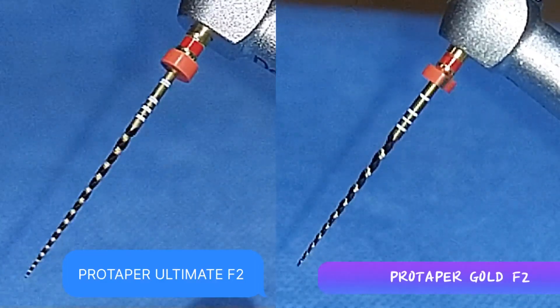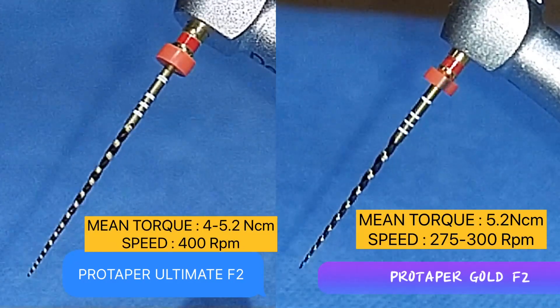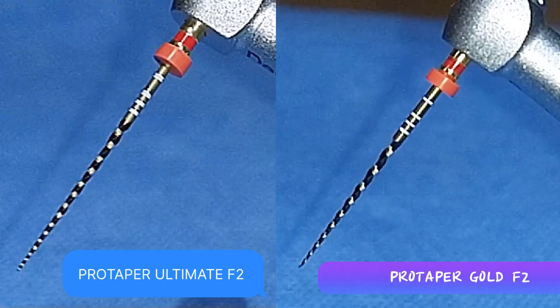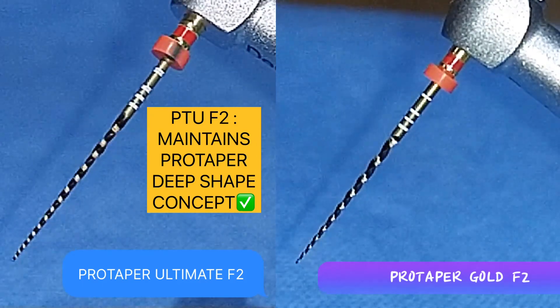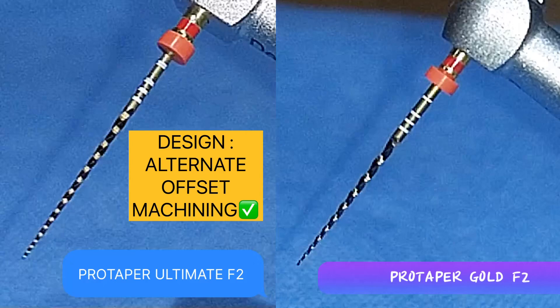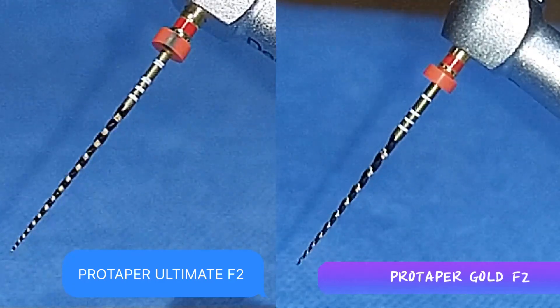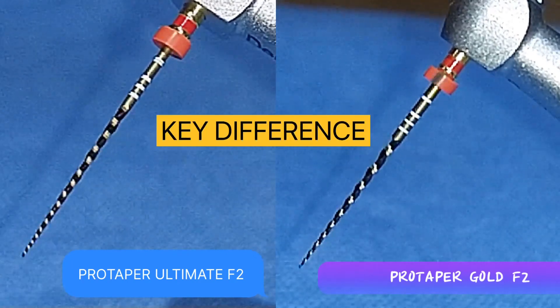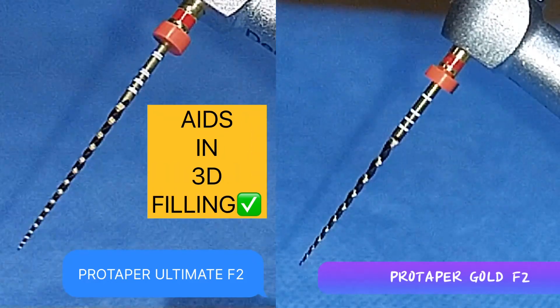A quick comparison between Pro Taper Ultimate F2 and Pro Taper Gold F2: both files run in continuous rotation but have different speeds and different mean torque values. Pro Taper Ultimate F2 maintains the Pro Taper Deep Shape Concept. It is made from purpose-specific Gold Heat Treatment and has alternating offset machining, maintaining better cutting efficiency. The key distinguishing feature is that Pro Taper Ultimate F2 follows Bernoulli's principle of funnel shapes, which helps in 3D filling.